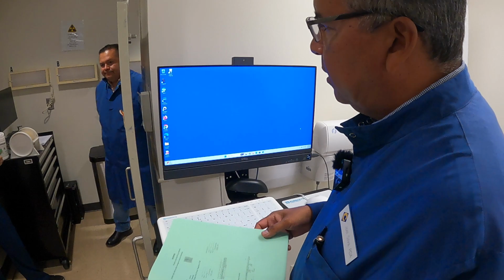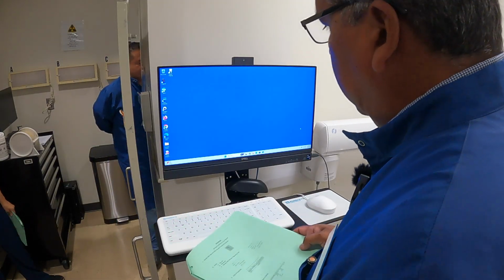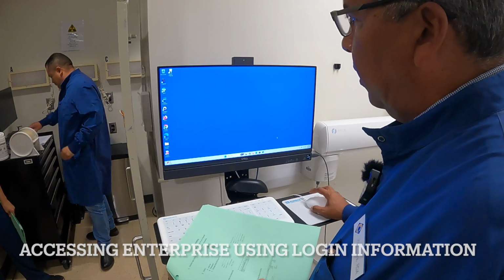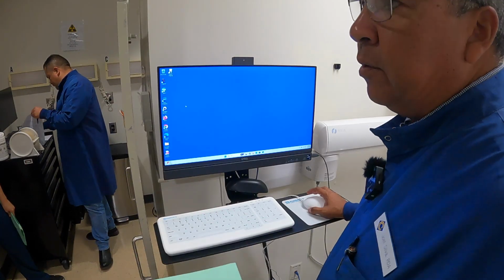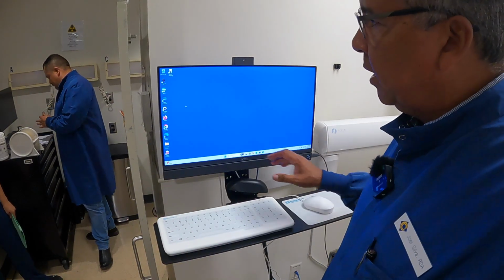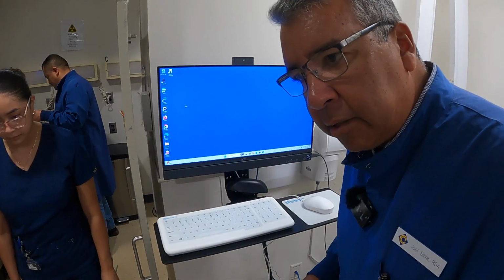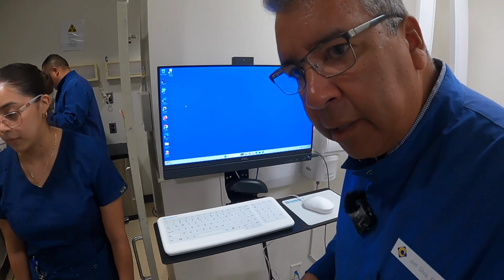In order to access some of the things that we need for digital radiography, we're going to go ahead and click on, there's a couple of things. And if you can all try to get a look at the screen, because this is what you're going to want to know. So let's kind of squeeze in there, pile up.